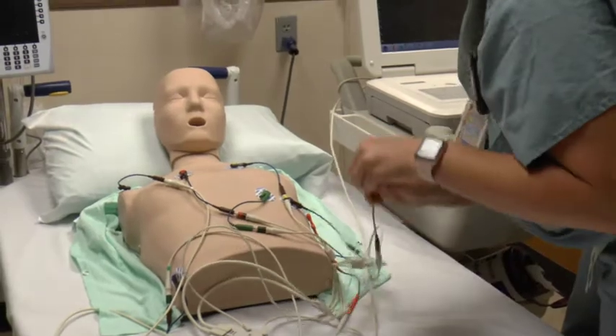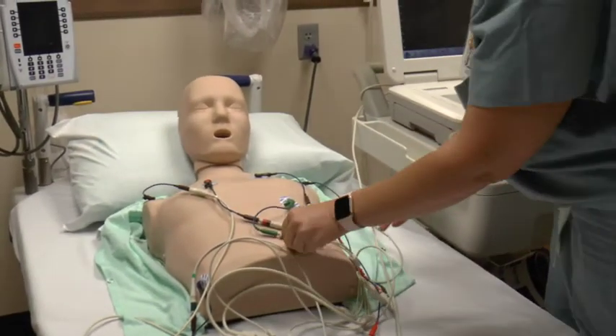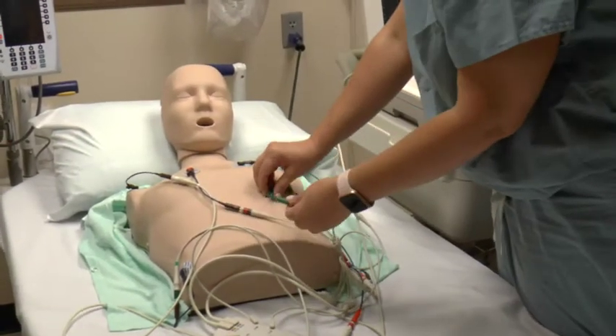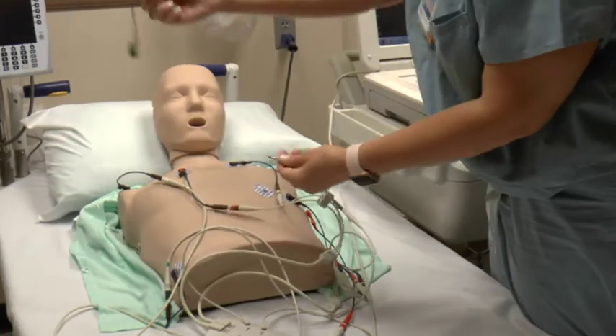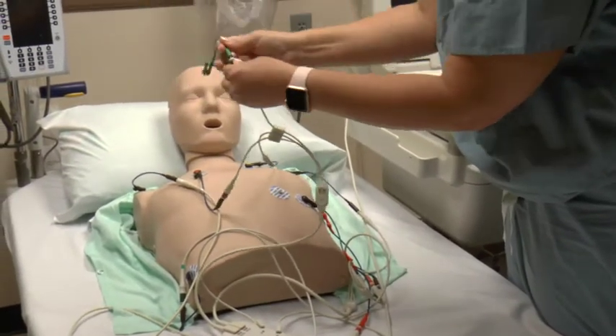Don't go by the colors — go by what it says on the leads, because sometimes they switch out the ends of the leads and the colors aren't right. So go off of what those labels are saying.